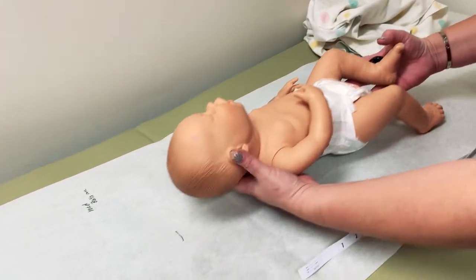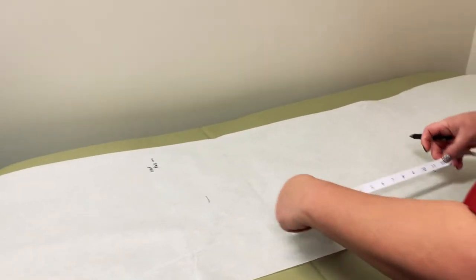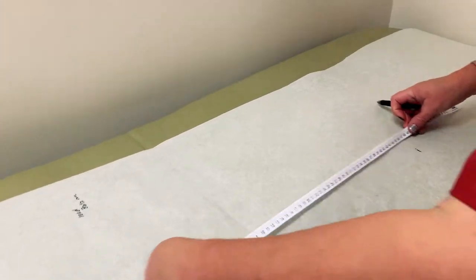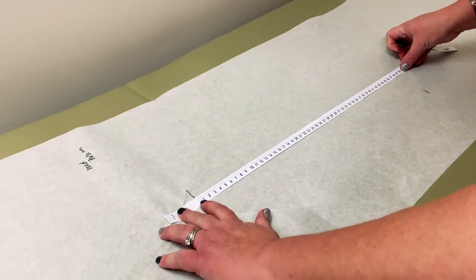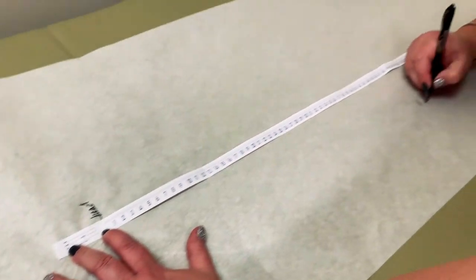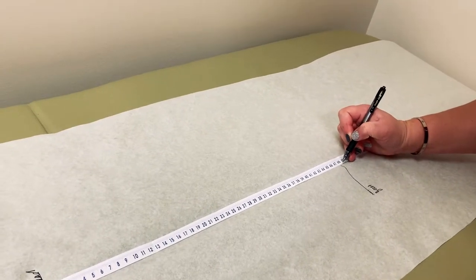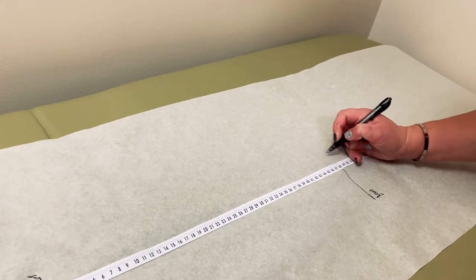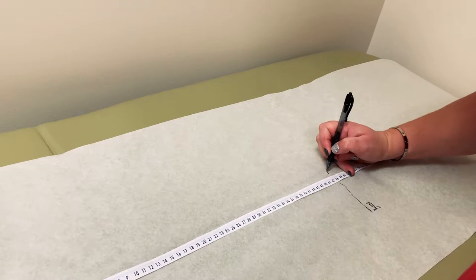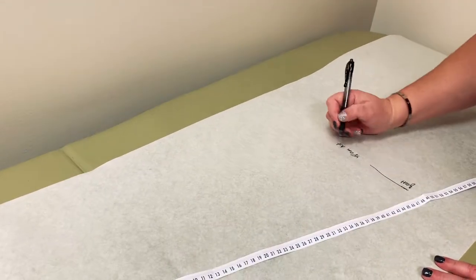Then you can hand the baby back to mom. The easiest way to do this is to line up your tape from the head mark at the top of the head and the bottom of the foot. We see that the baby ends up measuring about 48 centimeters — close to 48 centimeters, maybe just a hair under. So it's 48 centimeters for height, head circumference of 36 and a half centimeters.